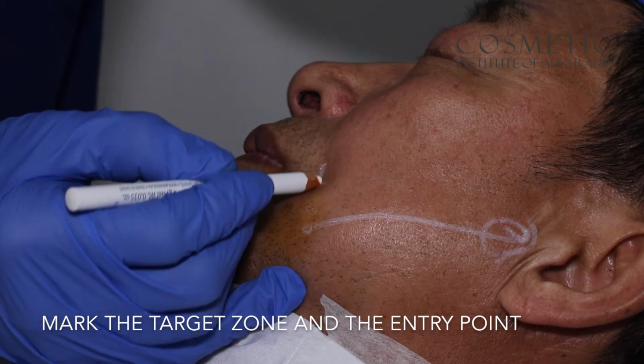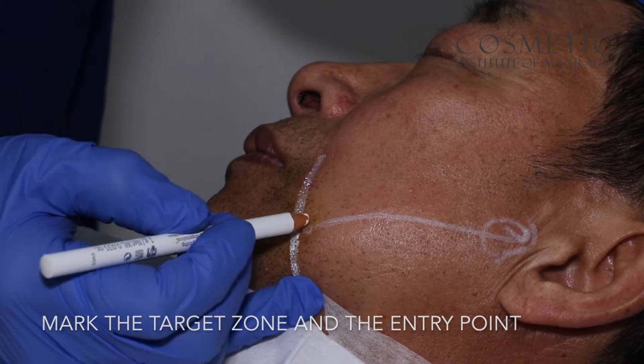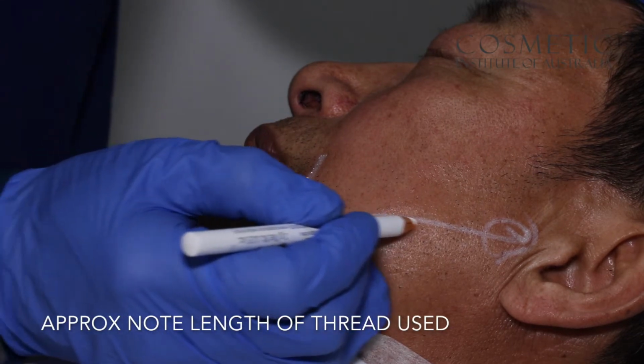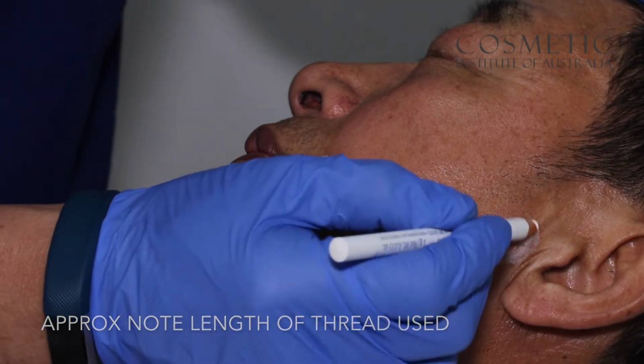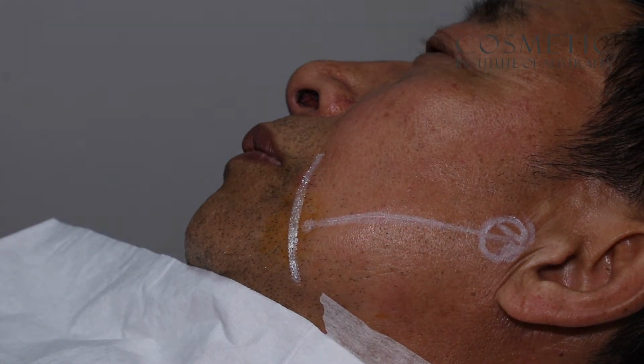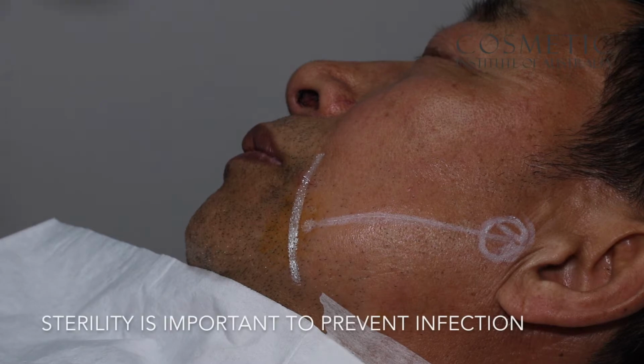Firstly, based on the clinician's design, mark the entry point and direction of the thread. This will help approximate the length of the thread. Secondly, clean the area with betadine.